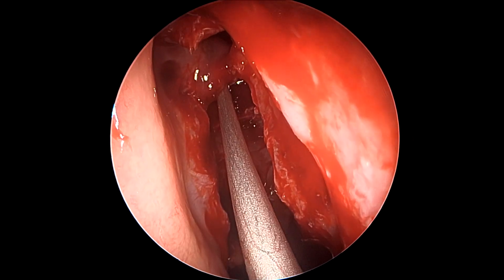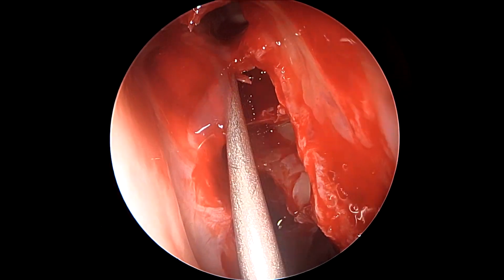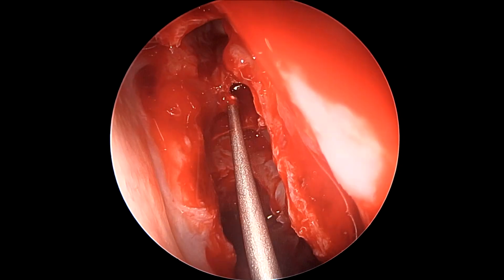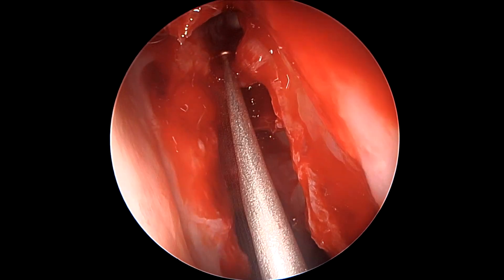And this is just because the anatomy here is easy. There are not many cells. You don't have any frontal bulla cells or any T3, T4 cells that obstruct our way. But when those cells are present, the frontal sinus dissection can become particularly troublesome and more complicated.